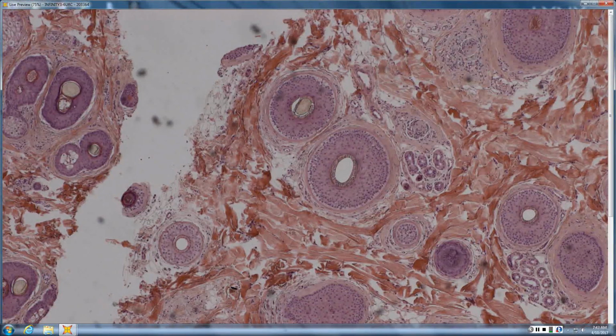The difference between the pigment cast and trichomalacia is that? I've heard the term. What distinguishes them? Pigment cast is just pigment. Trichomalacia is a softened, gelatinous hair, so you can clearly make out that it's a hair fiber. Okay. Hair fiber that's gone soft, whereas pretty much everything we're seeing here is just keratin, inner root sheath keratin, and pigment casts.